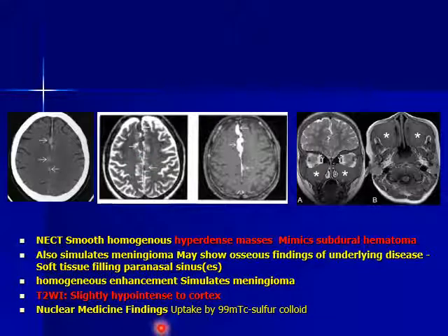We go to nuclear medicine because they actively uptake the technetium sulfur colloid, or if you do RBCs labeled technetium, they will show activity in these lesions. But we diagnose them indirectly by the presence of other signs of chronic hemolytic anemia.